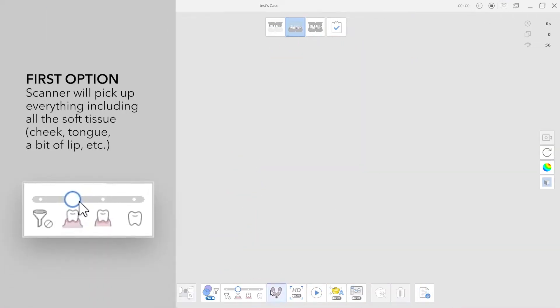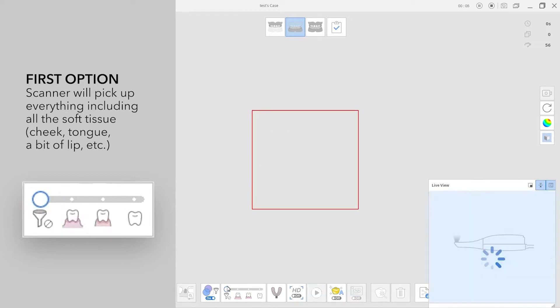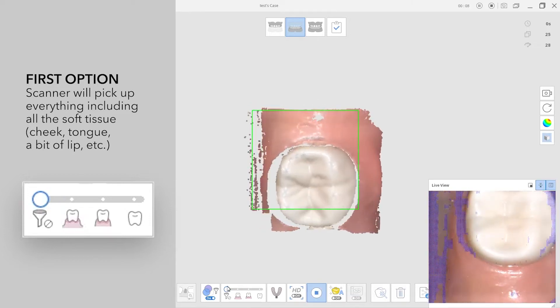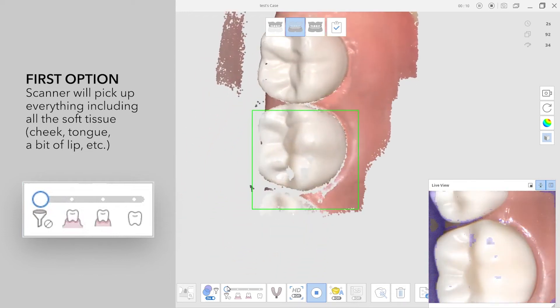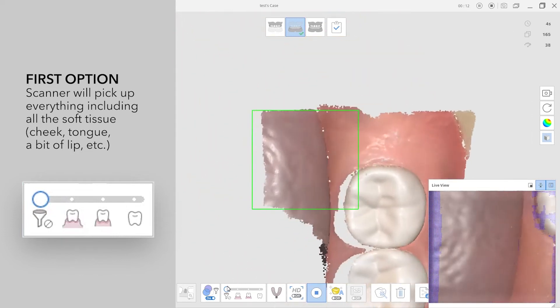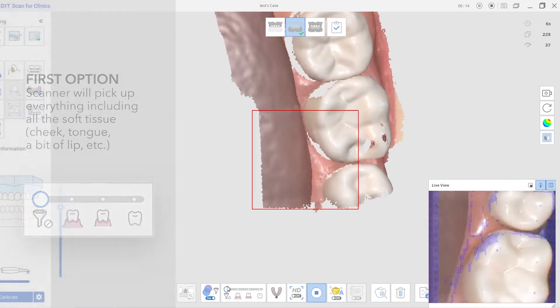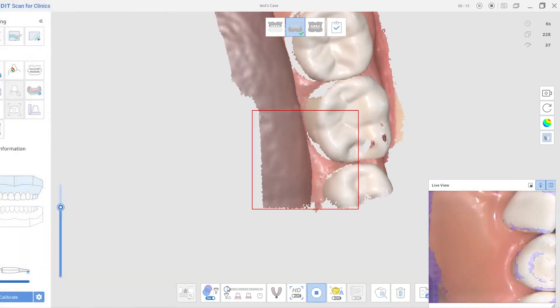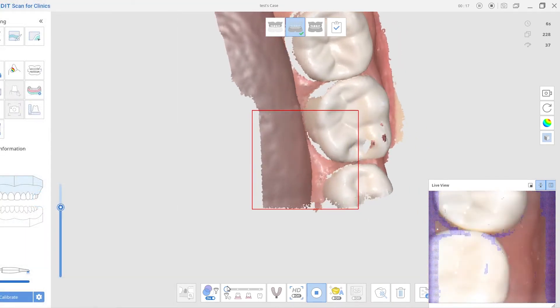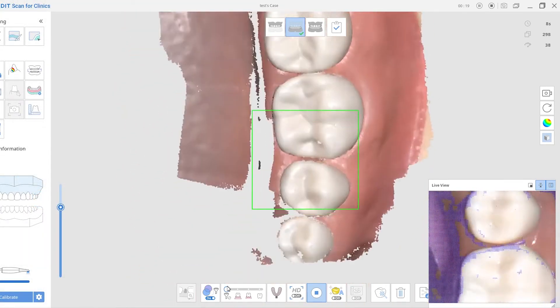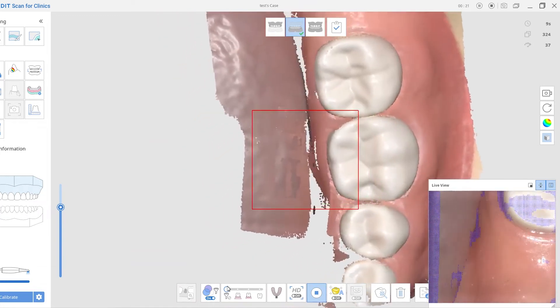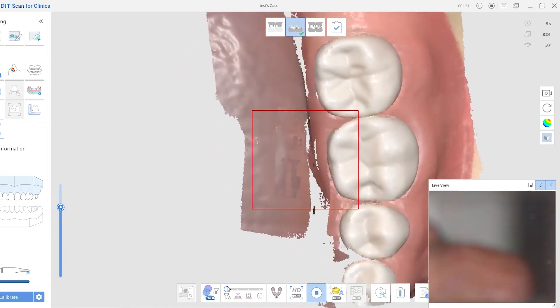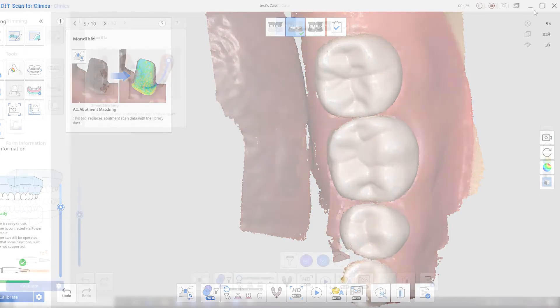If I take this ball here and slide it all the way to the left, this is a no filtering option. The scanner will pick up everything - all the soft tissues like the cheek and tongue, and lips. It's not going to filter any information out. It's going to leave the soft tissues there. This is really valuable when you're scanning edentulous patients because this may improve your ability to pick up the scan data.